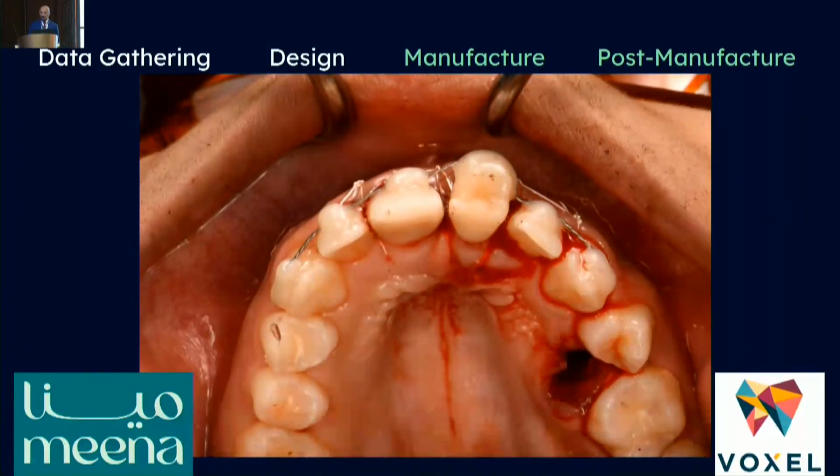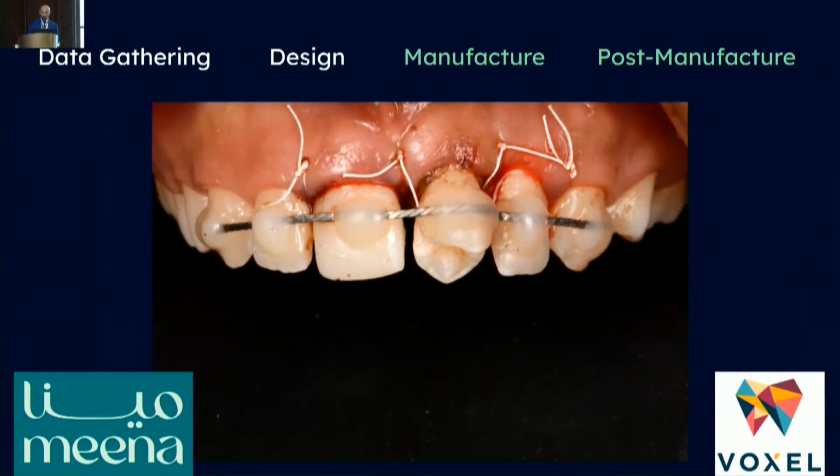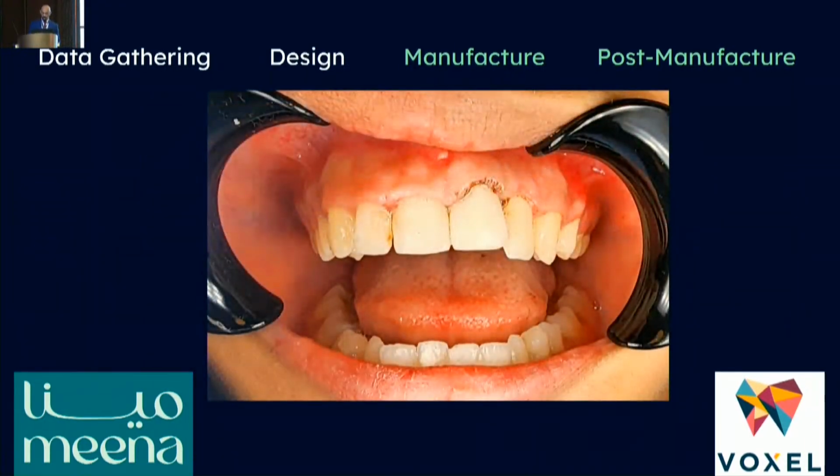The treatment ended with splinting the tooth in place for 1 week, after which root canal therapy was administered to the tooth. And here's the patient 3 weeks after treatment, healing nicely, with the mobility of the tooth drastically reduced at this stage. And so the tooth was reshaped by Dr. Hassa via rotary instrumentation, and composite resin was used to gain this beautiful result for this young patient, allowing them to function and live a normal teenage life until future intervention is possibly needed when they grow into adulthood.